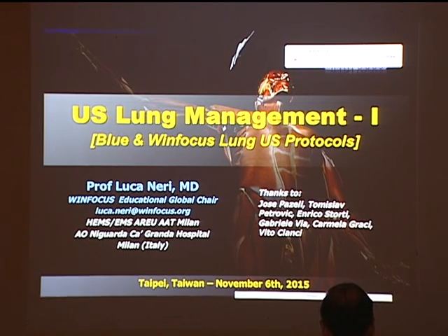Okay? So you could have a lung moving because the other lung is being ventilated, and maybe the right lung could be not ventilated properly but still moving. But most of the time, when you see the sliding sign, that means visceral pleural mobility, it means ventilation of the lung.